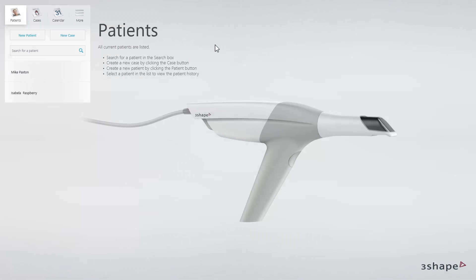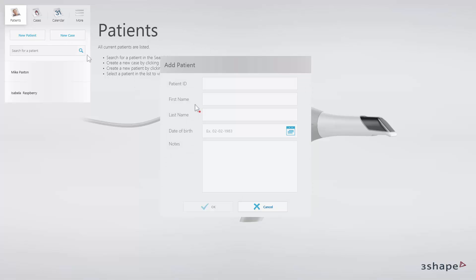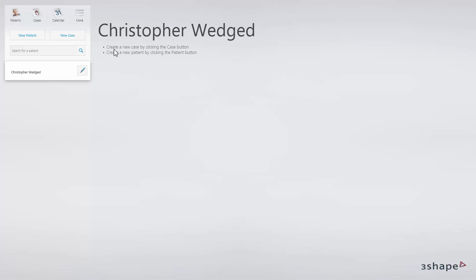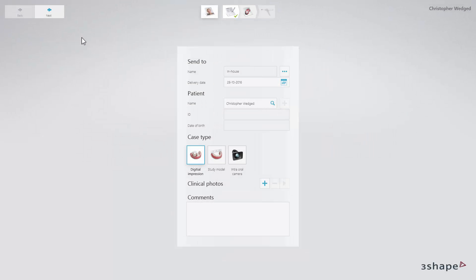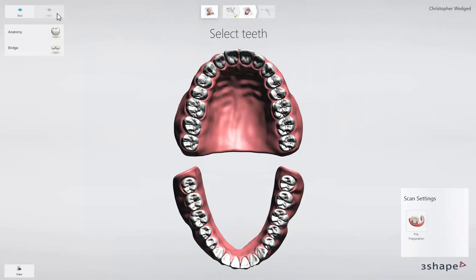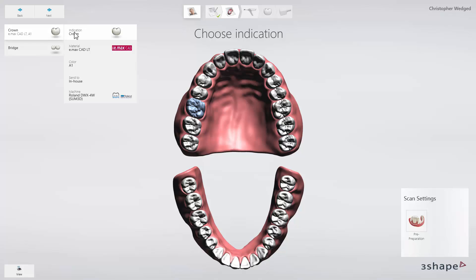You can start working on the next restoration on the patient page. To create an order form, click on Patient and fill in the details. Then click on Case. The current stage is highlighted and marked green when accomplished. In the second stage of order form creation, choose Tooth, Type of Restoration, Material, and Color. Click Next.